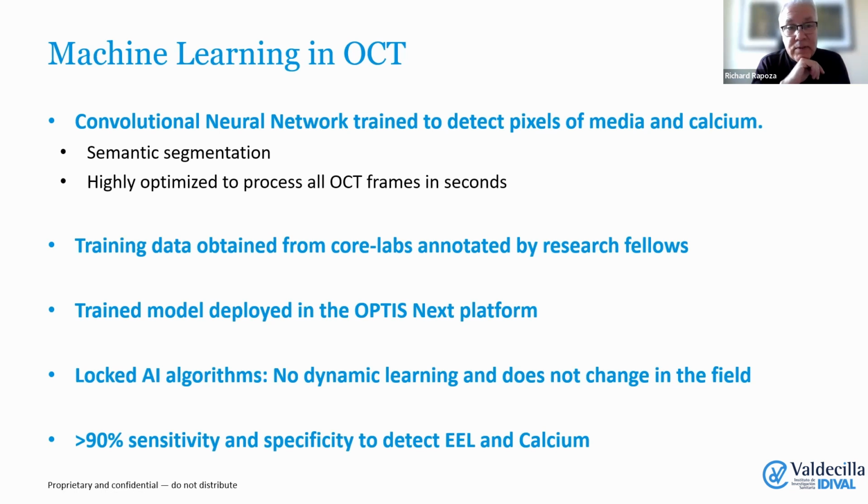We prioritized those two primarily because we had invested a substantial amount of money in running the Illumien 4 trial. Many of you participated in the trial. Thank you for that. The premise of the trial is that using OCT in addition to angiography will improve your ability to decide what sizing and what preparation techniques you need to use, what size of stent you need to use, and to achieve a larger expansion of stents.